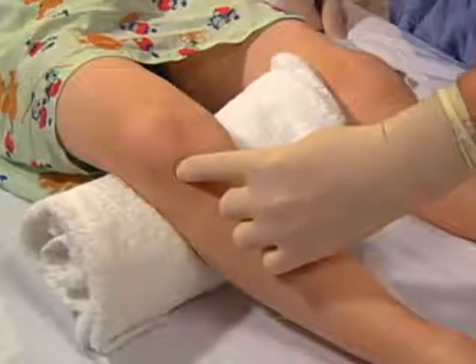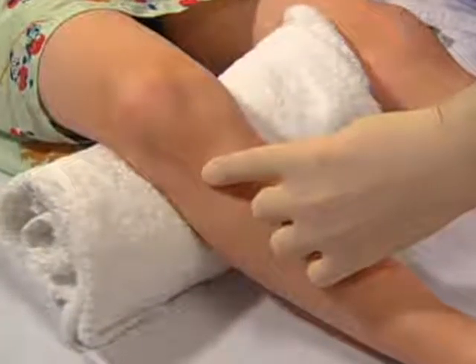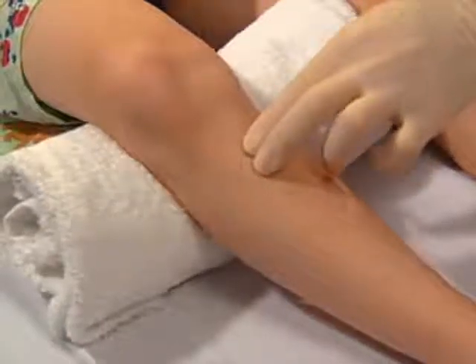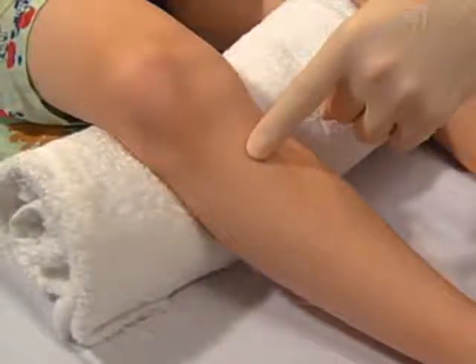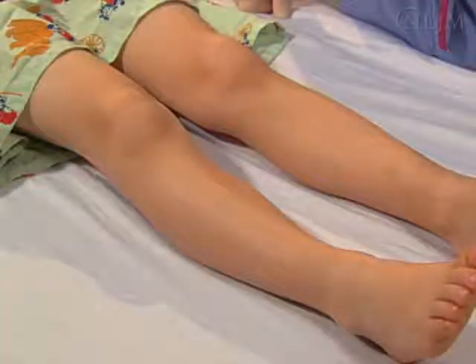Identify the lower pole of the patella. The prominence immediately below it is the tibial tuberosity. 1 to 2 centimeters inferior and medial to the tuberosity is a broad, flat surface of tibia that serves as the targeted insertion site.